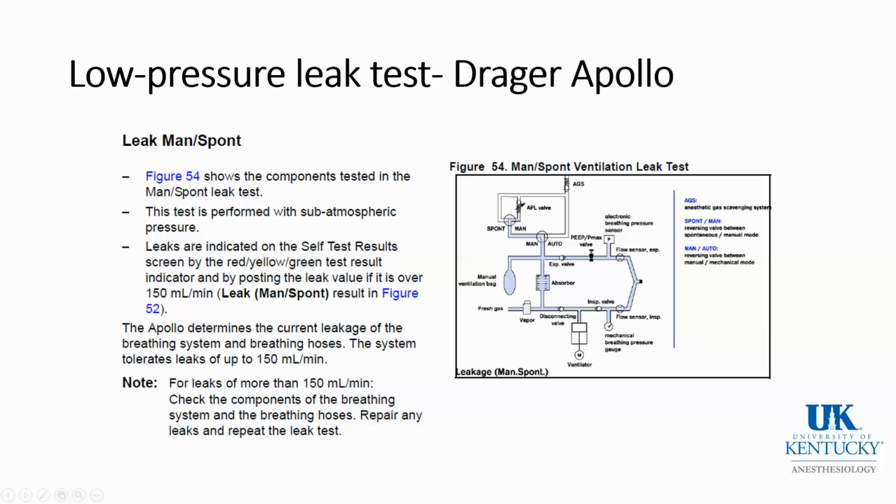At some time you should probably practice or test an Apollo machine and breathe through the circuit with an inadequate amount of flow, and see what happens when you get to a negative pressure. There is a valve in the machine which should open up and entrain room air.